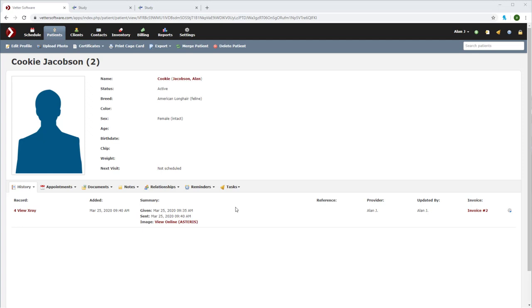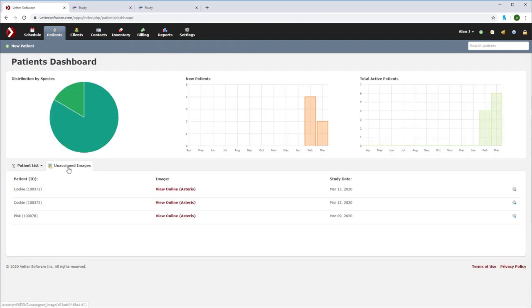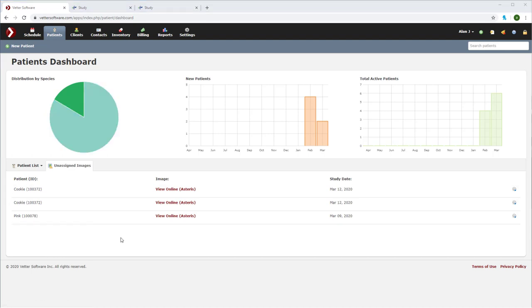Once the patient is stable and you have time, go into the patient section of Vetter. Select the unassigned images tab. Now we can see a list of images that are unassigned. Find the patient that you took the x-rays on during the emergency.